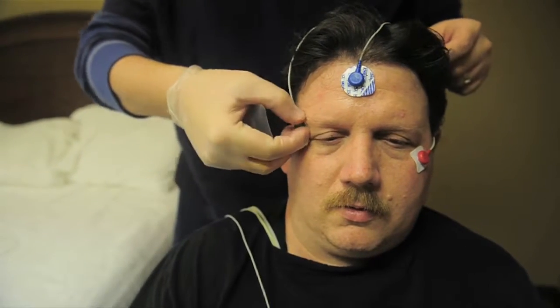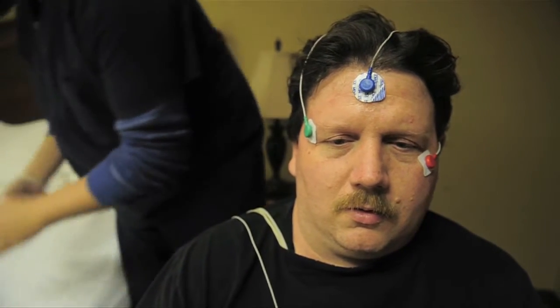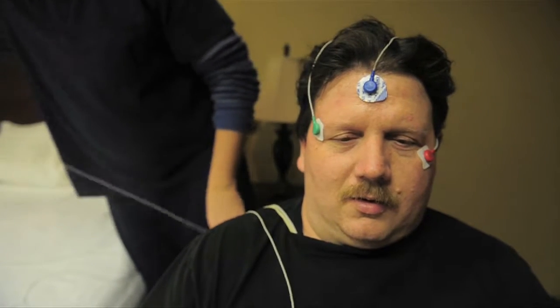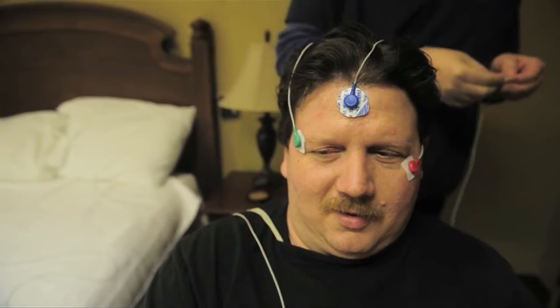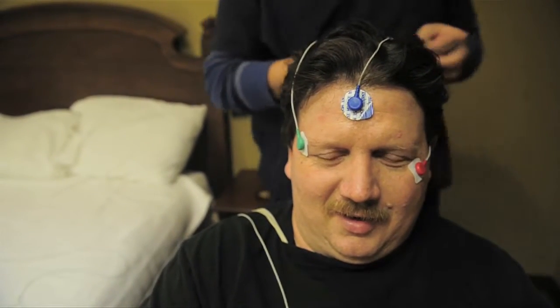From there we put some leads just off to the side of their eyes that help us see if they are going into REM sleep — we can pick up eye movement. We also put some along their jawline, or on their chin if they're clean-shaven, that help us see if a person's gritting or grinding their teeth.